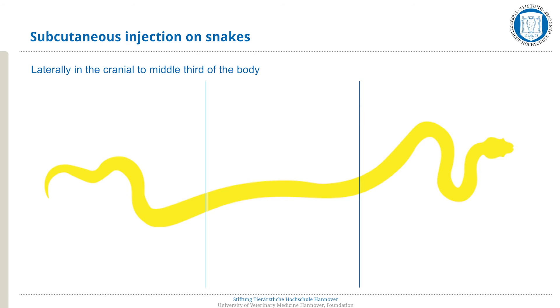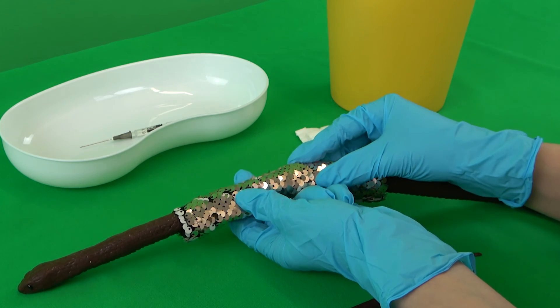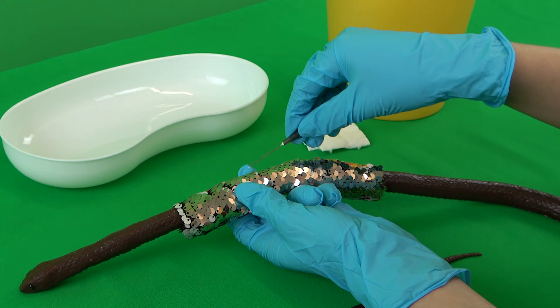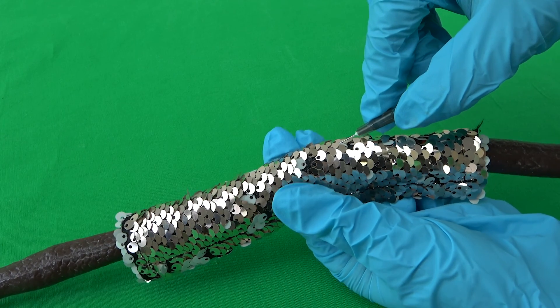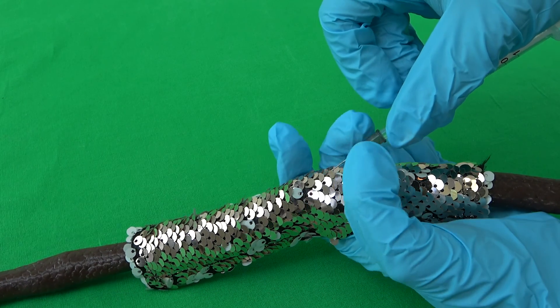The subcutaneous injection on a snake is done laterally, in the cranial to middle third of the body. The body of the snake is fixated with the thumb and index or middle finger of the non-dominant hand. The dominant hand holds the prepared syringe by the cannula hub. To minimize the chance of harm by the patient recoiling, it is wise to always puncture in a cranial direction. A shallow angle of 30 to 45 degrees should be used to puncture the skin underneath the scale. The cannula's bevel should be pointing away from the patient. A proper puncture with the cannula can be tested with the index finger of the non-injecting hand. The cannula should be slightly movable and palpable.